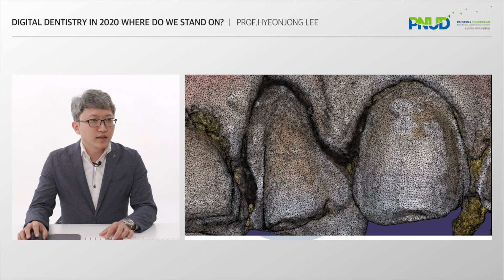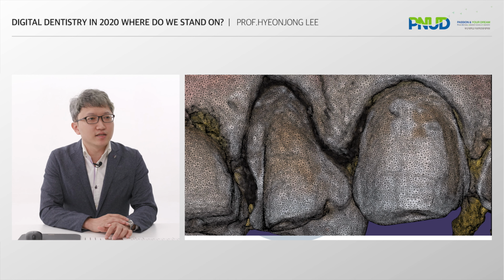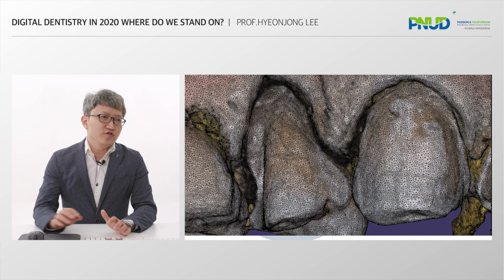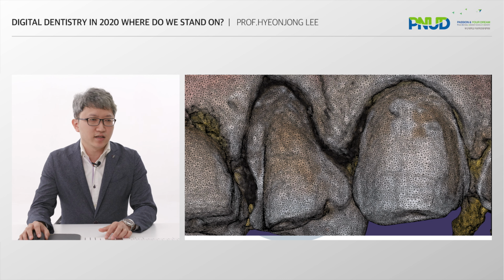So let's see. Actually, this is the real surface of an intraoral scanner as it is. There are so many small triangles, but usually we don't see this kind of triangle.